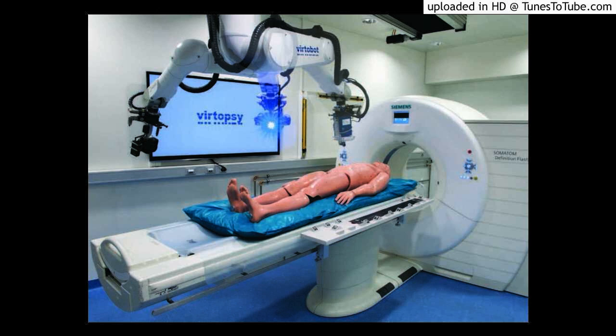Considering these objections, and in an attempt to ameliorate the autopsy results, alternative aids in diagnosing the cause of death were developed. Use of imaging for medico-legal purposes was seen in forensic practice since 1896. Numerous cases were reported in which liver, heart, brain, and bone injuries were investigated radiographically, revealing the possible cause of death.